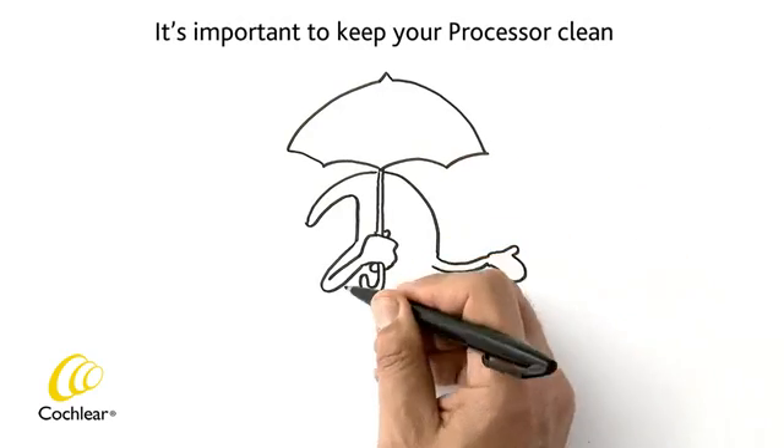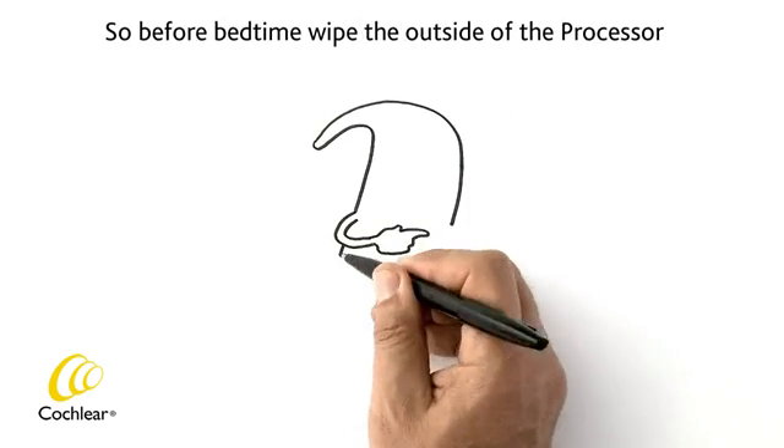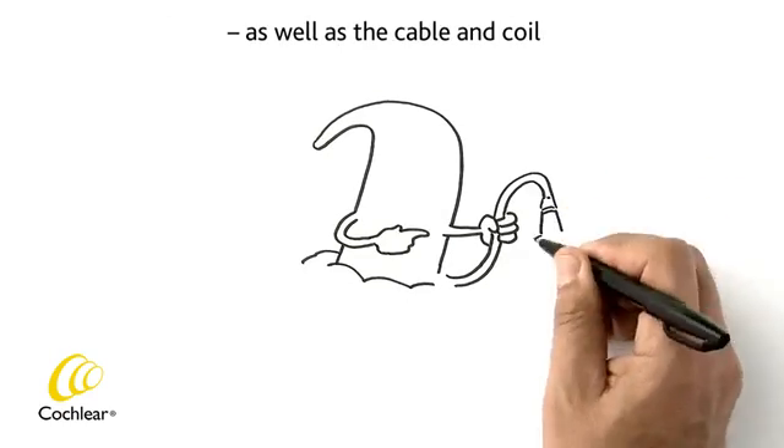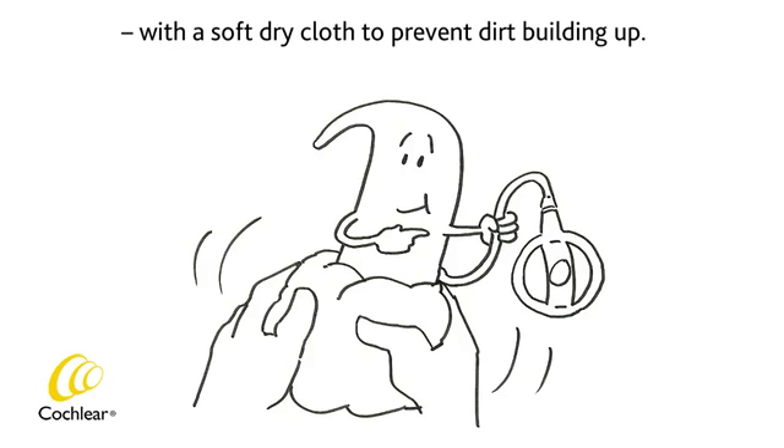It's important to keep your processor clean and free from moisture on the inside. So before bedtime, wipe the outside of the processor, as well as the cable and coil, with a soft dry cloth to prevent dirt building up.